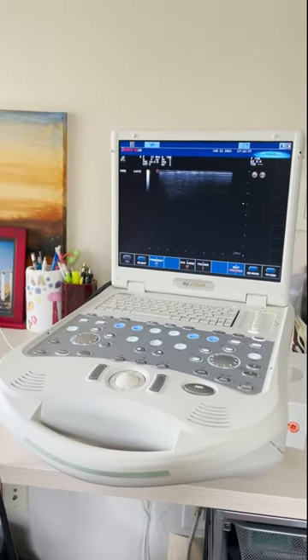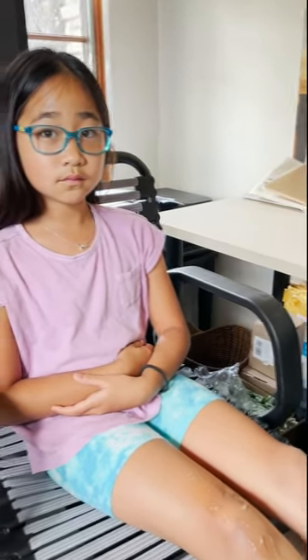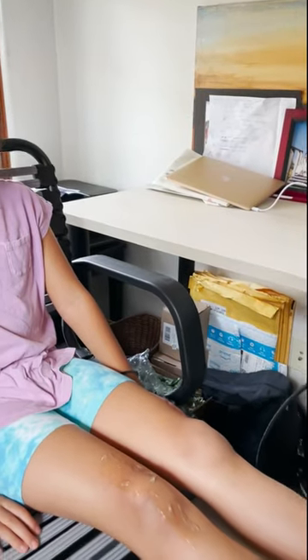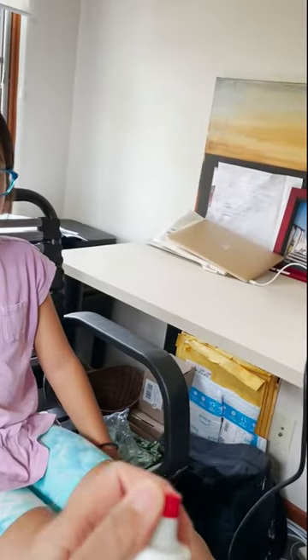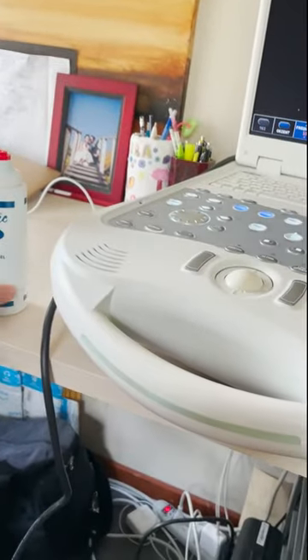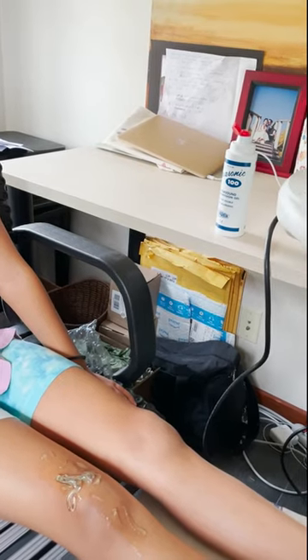Because I'm on vacation this week, we have set up this ultrasound machine at home and my daughter Kira will demonstrate the techniques we use to do an ultrasound. Because ultrasounds are usually done by the bedside, the patient is usually awake. Patients are usually asked to wear loose clothing and sometimes a hospital gown. We ask that the patient sit or lie down in a comfortable position. After they are in a comfortable position, we apply some gel to the patient in the area we want to look at, and then use the probe to create the picture on the ultrasound screen.